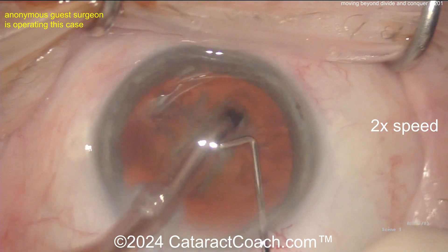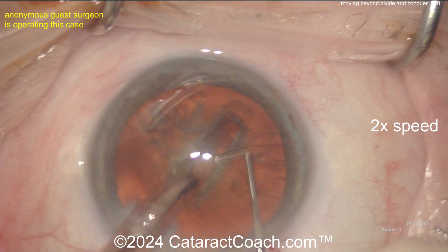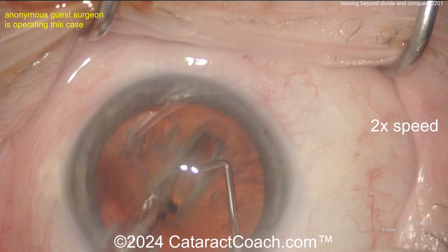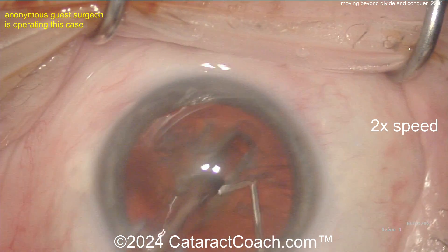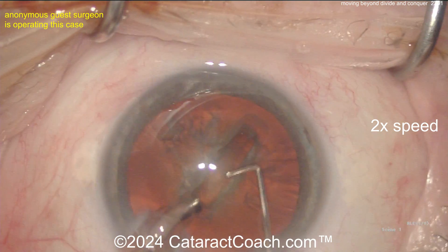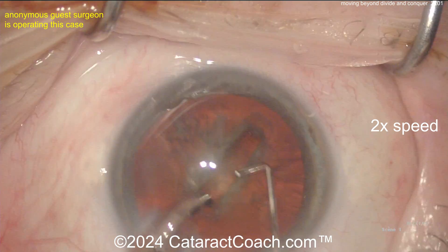Notice the groove is starting not sub-incisional but more in the center of the nucleus, so you may want to rotate this 180 degrees before cracking — complete that groove a little bit longer. That's pretty good; I'd stop about here, I don't think you need to do much more than that.